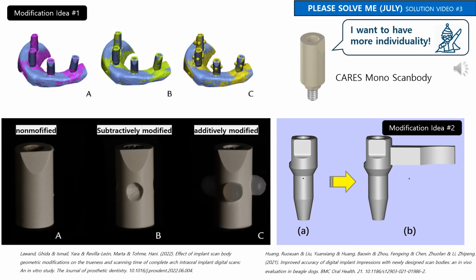For example, MyPlant2 and Straumann scan bodies have a simple cylindrical shape with only one D-cut plane. Alignment would be easier if the scan body had 2 different D-cut shapes or a more complex design. However, many manufacturers stick to simple shapes due to patent issues. While we could manually modify the scan body to make it more complex and register the modified version in the Medit software for easier alignment, this is too complicated, so it's not a practical solution.